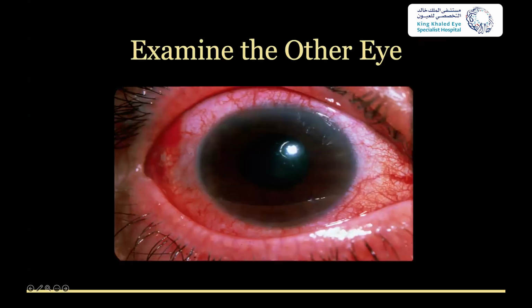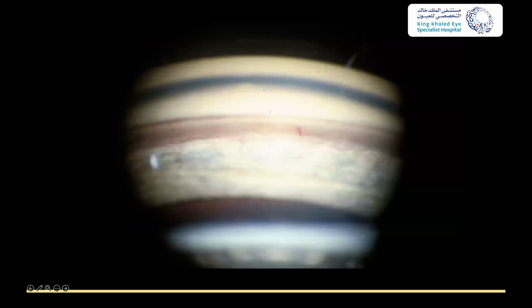So the resident might come up to me in the hallway and say, I've got this guy, he's an acute angle closure glaucoma. Can't see his angle because his cornea is so steamy. I always ask them two questions. What's the refractive error? If it's -3, you might want to rethink that diagnosis. And what does the other angle look like? Because if the patient is phakic in both eyes and the other angle is wide open, probably not primary angle closure glaucoma.